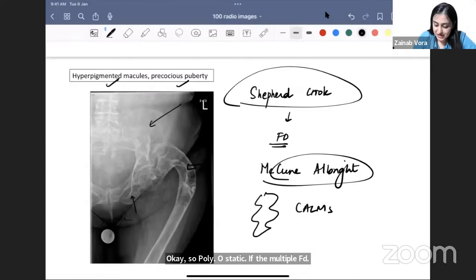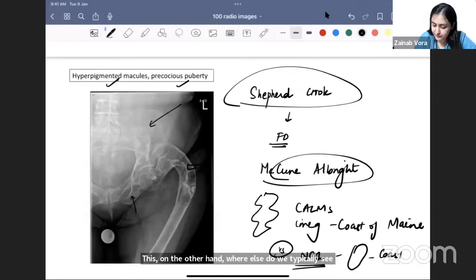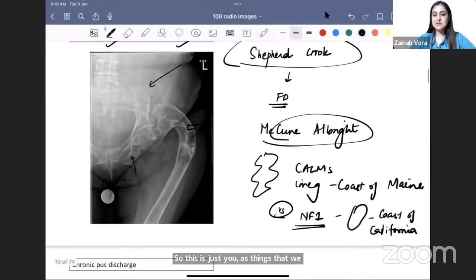The café-au-lait macules in McCune-Albright syndrome have an irregular boundary, likened to the coast of Maine. In contrast, café-au-lait macules in NF1 are very smooth, likened to the coast of California. On the image you can see the iliac blade and pubic bone are also expanded, indicating multiple bones are involved — polyostotic fibrous dysplasia.